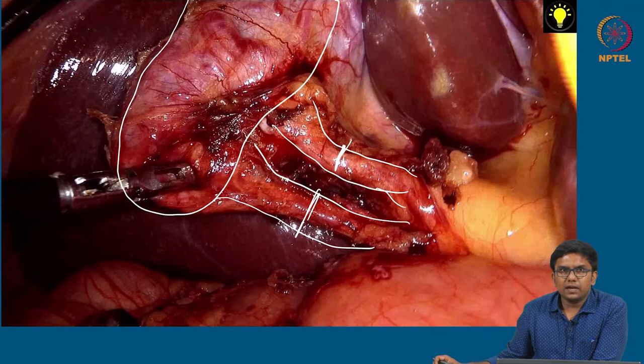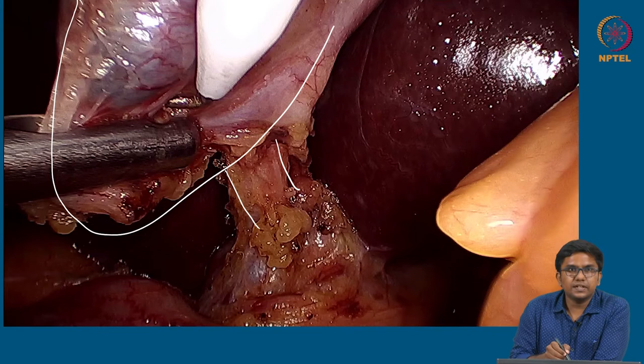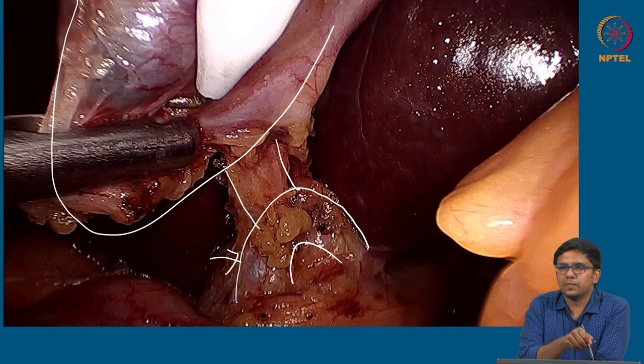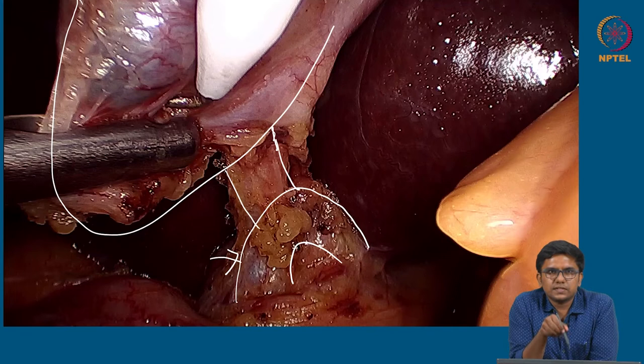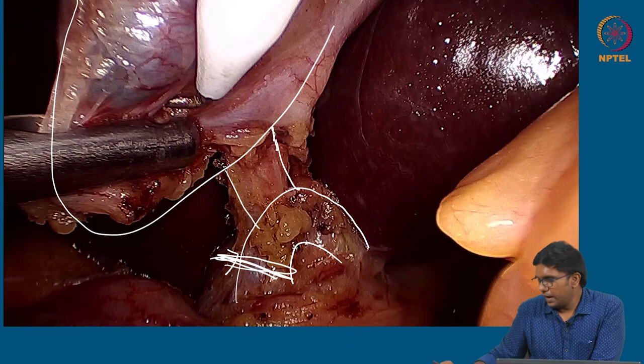Let us take another example. This is another picture of the same cholecystectomy surgery. We have the gallbladder here; the cystic duct here is very short, and with this short cystic duct, while operating, the surgeon tends to pull the common bile duct here. We are not supposed to go near the common bile duct during gallbladder surgery, and there are high chances that a beginner surgeon can consider this structure to be the cystic duct, go near it, clip it and cut it. This is the major idea behind using artificial intelligence in intraoperative tissue identification.